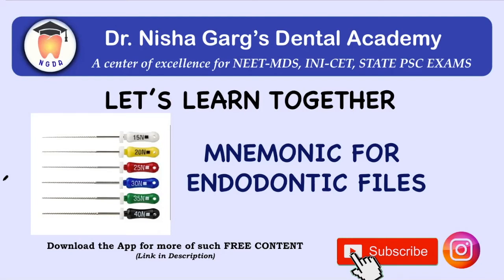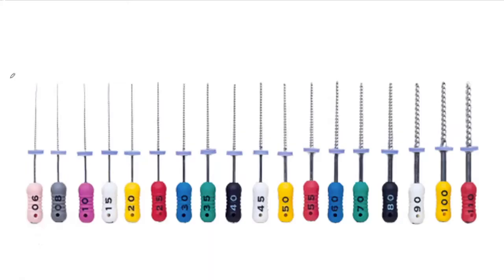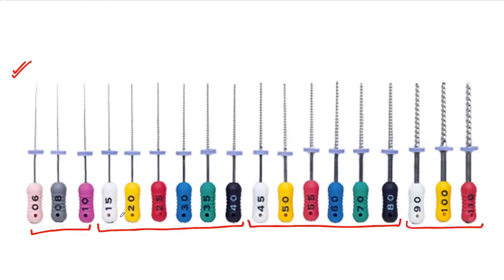Hello everyone. In today's video, let's learn a trick to remember the color coding for endodontic files. If we look at this image of endodontic files, except for these three files, there is certain color coding for the set of files which is repeated after the set of 6 files. What is the color coding?